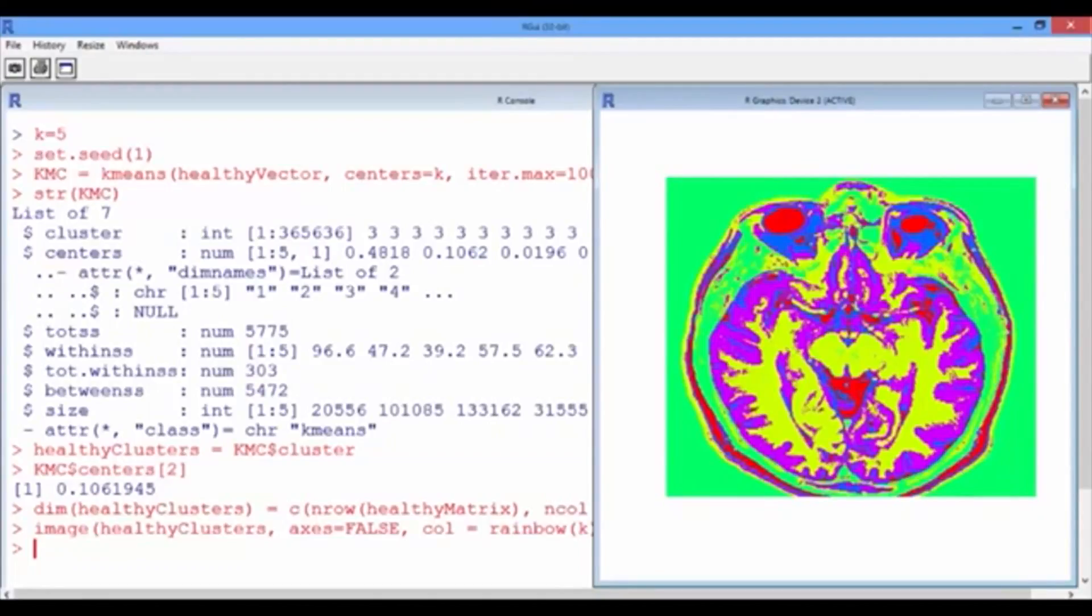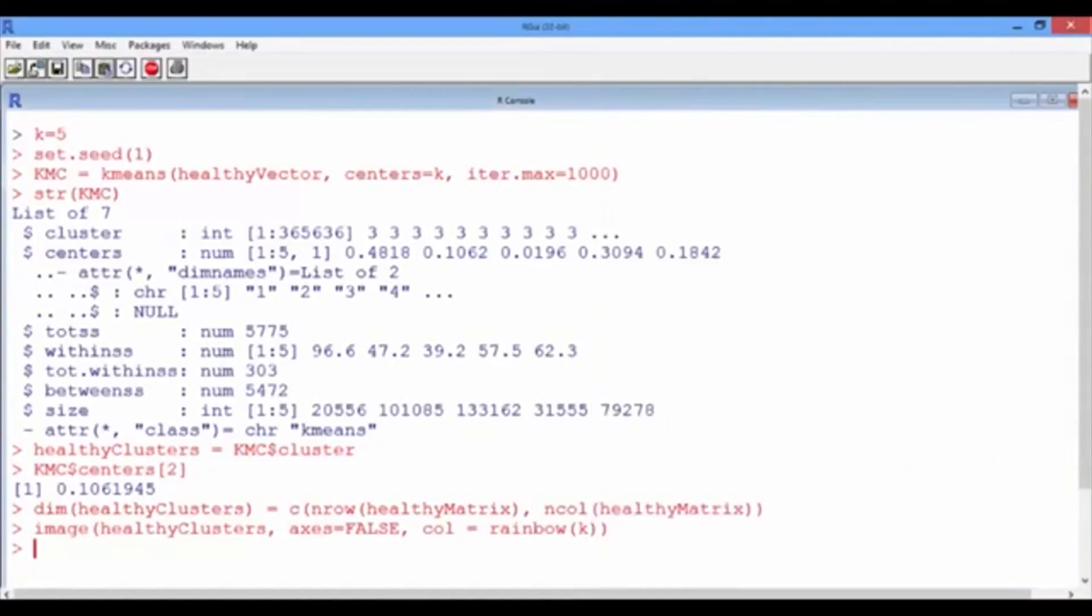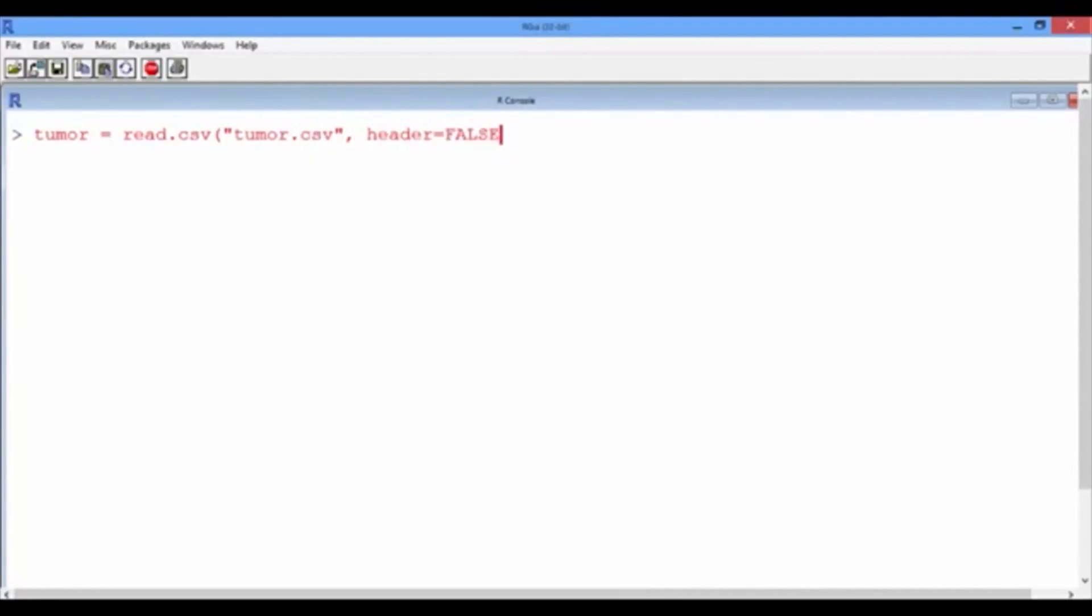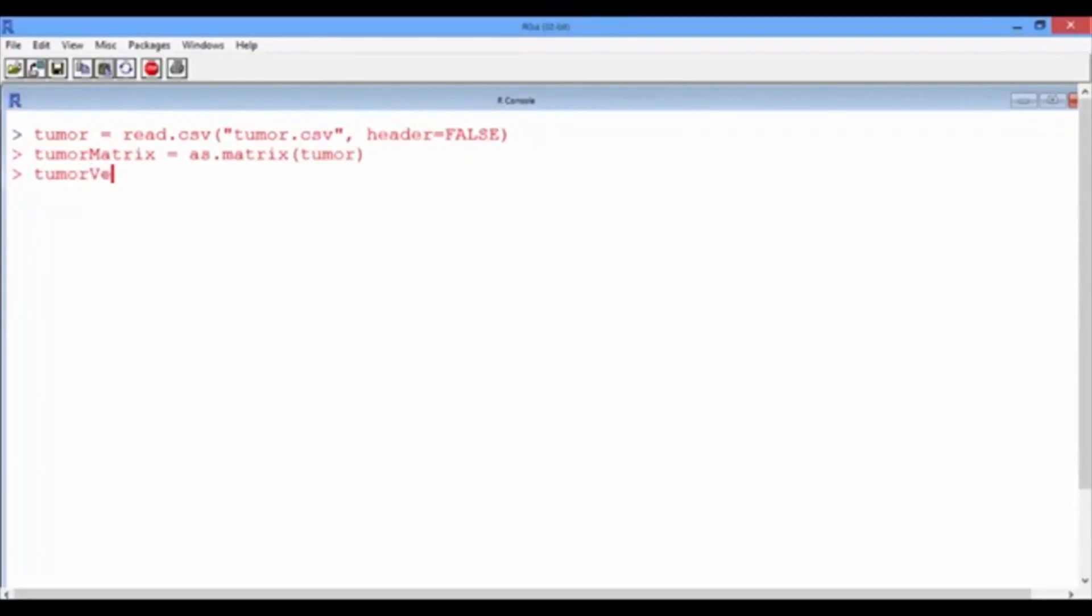Now make sure that the tumor.csv file is in your current directory. Let's go to the console and clear it and then read the data and save it to a data frame called tumor using the read.csv function with header equals false. And let's quickly create our tumor matrix using the as.matrix function over the tumor data frame and the tumor vector using the as.vector function over the tumor matrix.